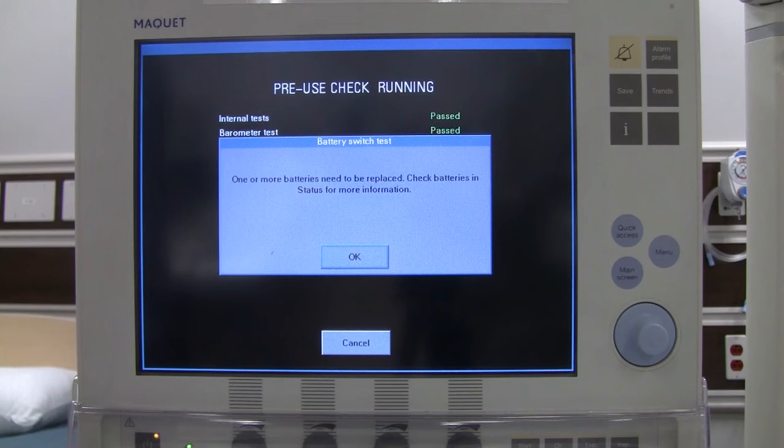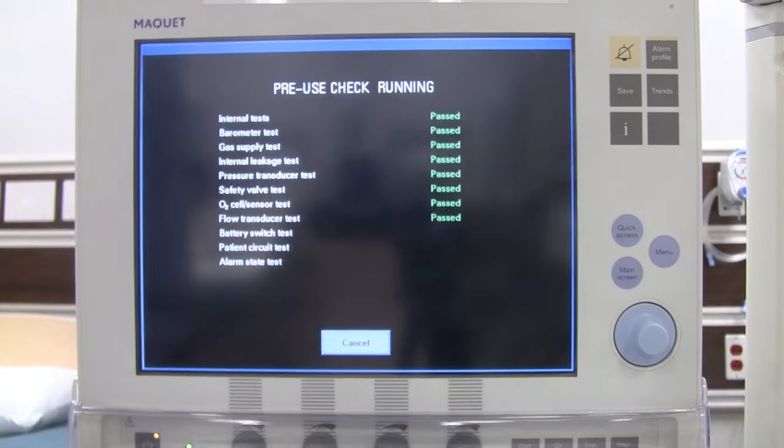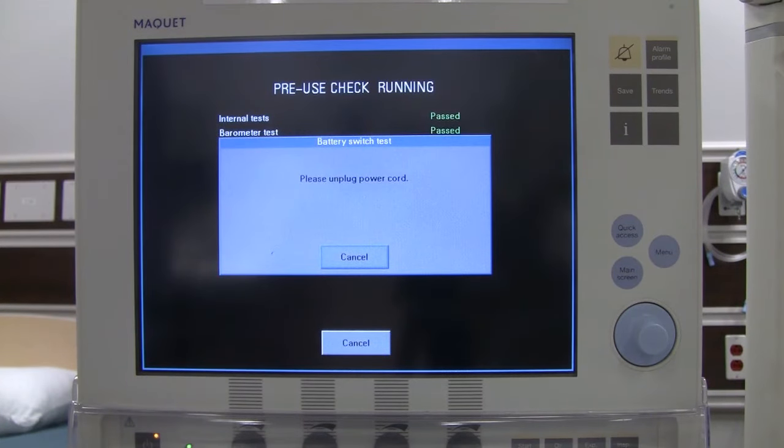One or more batteries may need to be replaced — we know we have some bad batteries in this unit since it is an old one, so we say OK. The ventilator will ask you to unplug the power cord momentarily to test the batteries, then it will ask you to plug it back in.